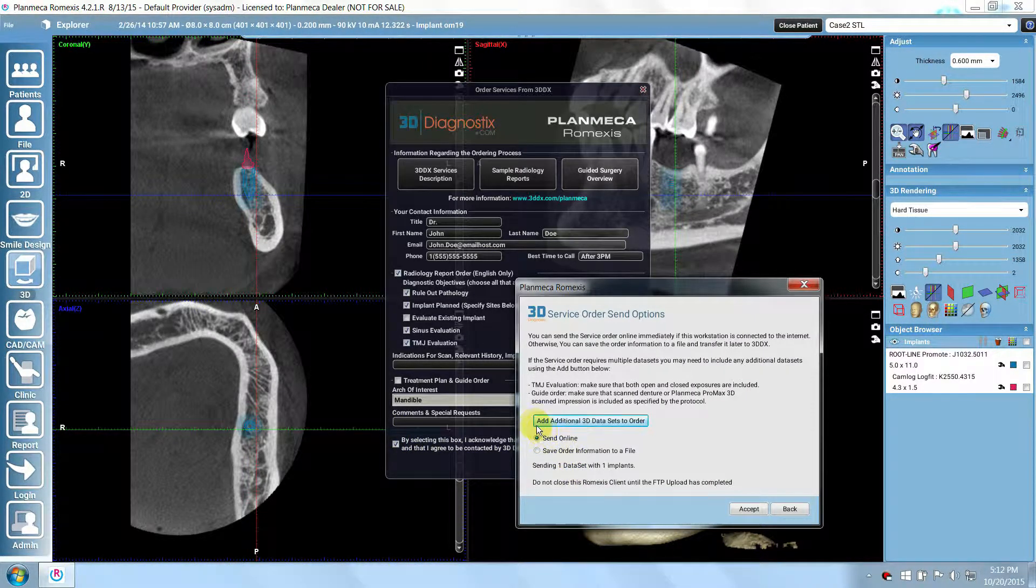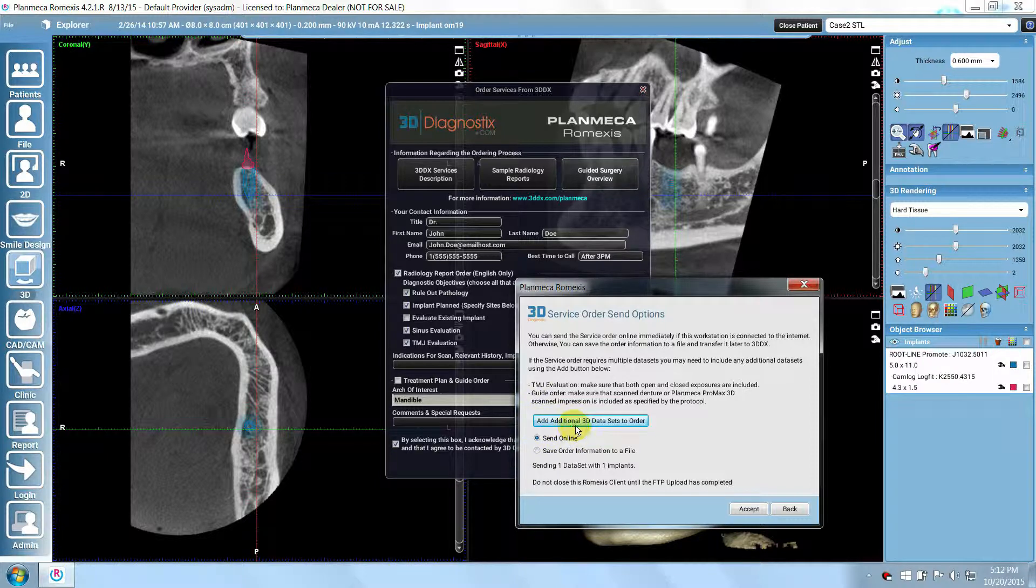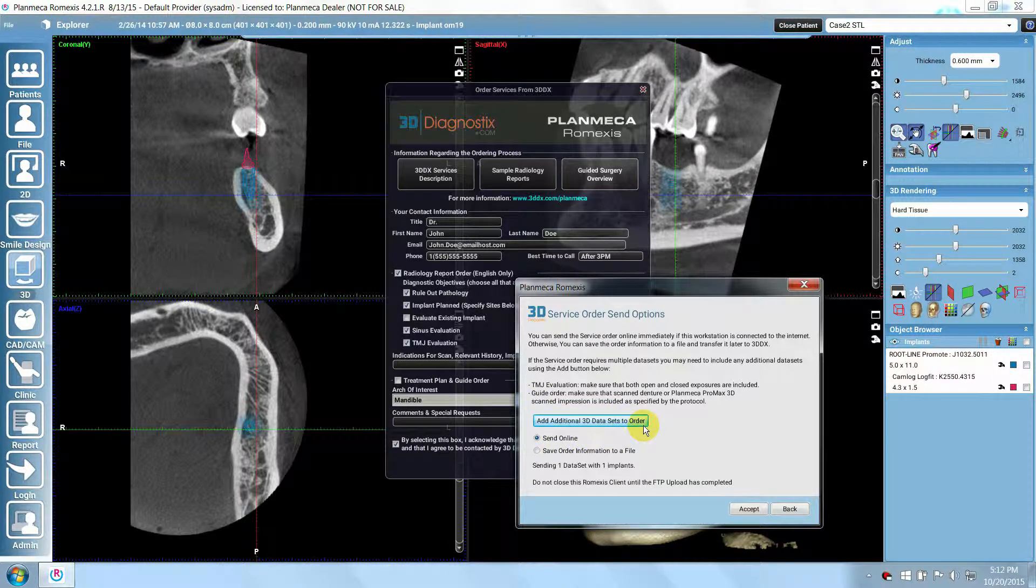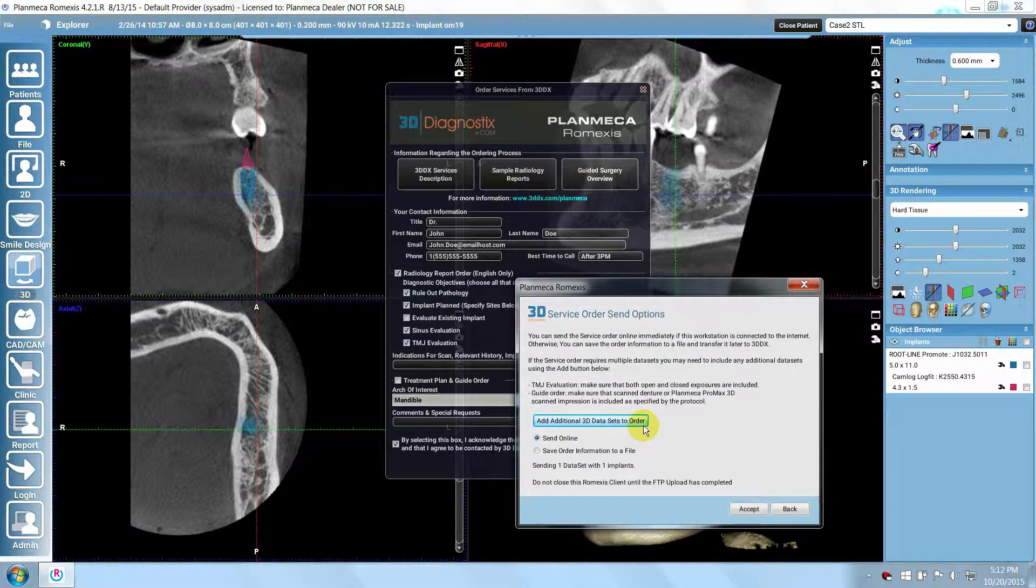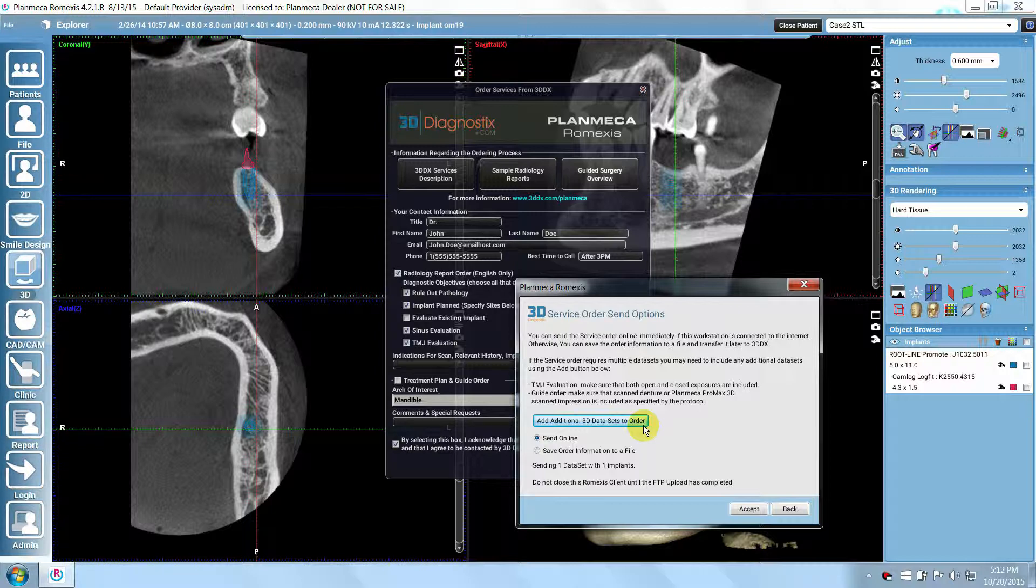On the next window, you may choose to add any additional 3D datasets to your order, such as scanned dentures or any other datasets you may have.